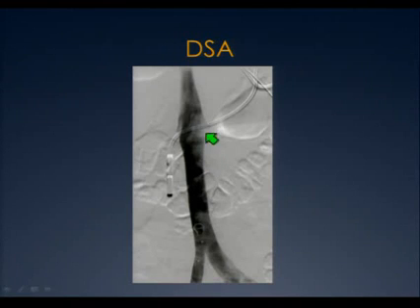This is inflow from the renal veins. The renal veins are bringing in blood that's unopacified. Now, if you just use a fluoro video clip, you probably wouldn't see that subtle finding. You need to know exactly where the renal veins are so that the filter is put just below the renal veins. What else is here? This is a feeding tube. That's not important. You see the colon is subtracted out, but this is a really nice picture.